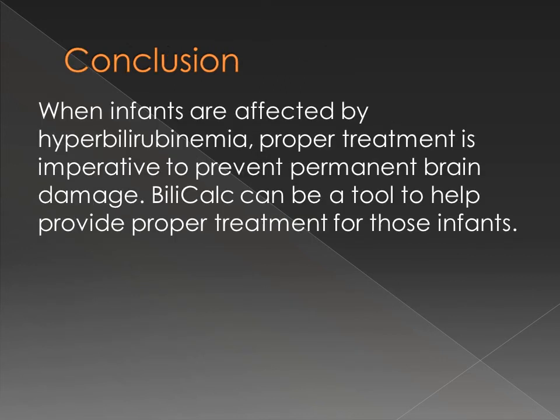When infants are affected by hyperbilirubinemia, proper treatment is imperative to prevent permanent brain damage. BiliCalc can be a tool to help provide proper treatment for those infants.